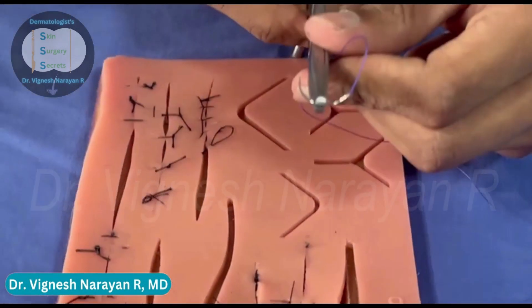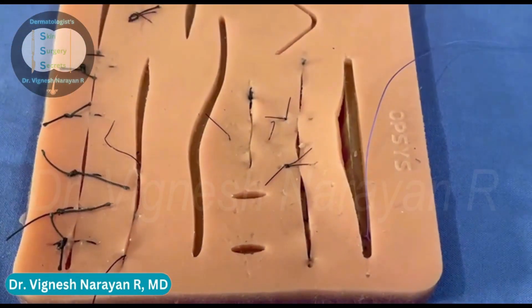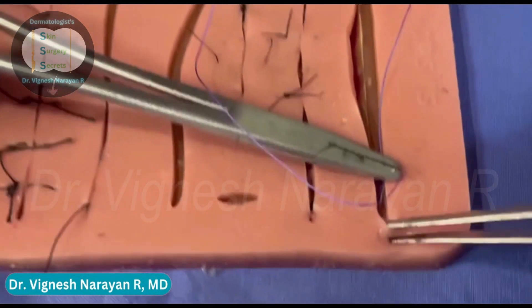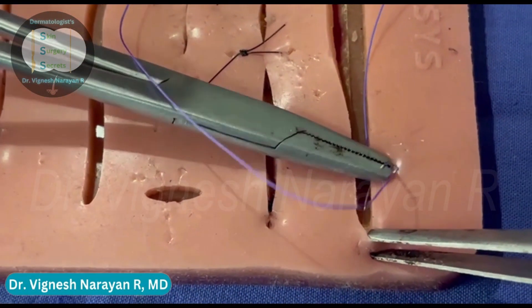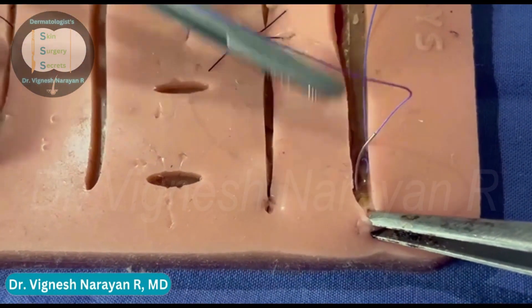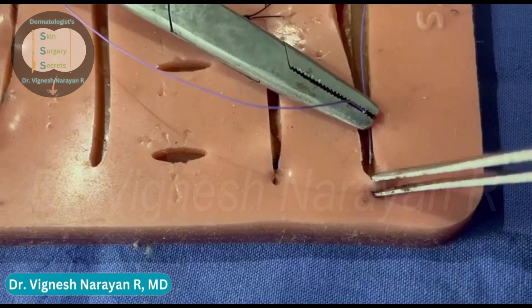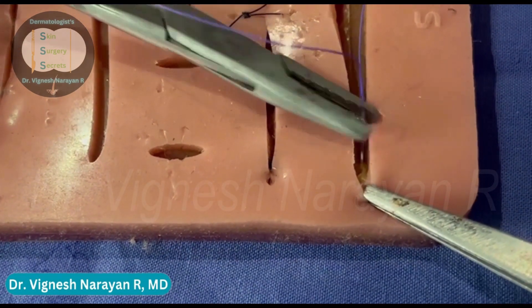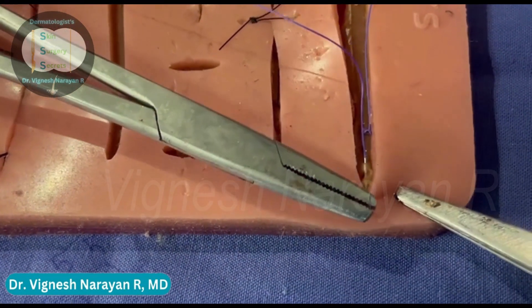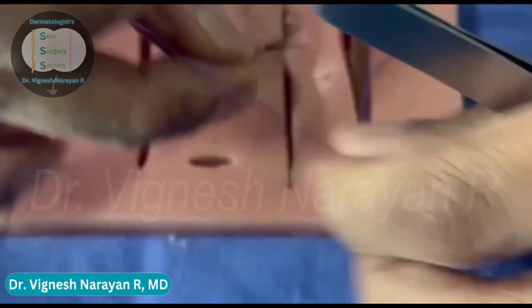Next, I'm going to take the apical stitch. This stitch is done with a reverse grip. We're going through the subcutaneous plane and coming out at the dermis. You can see it's going through the yellow subcutaneous tissue and coming out through the dermis. It helps to evert your tissue with the forceps so that you're in the right plane. Now we have secured the subcutaneous tissue to the dermis.